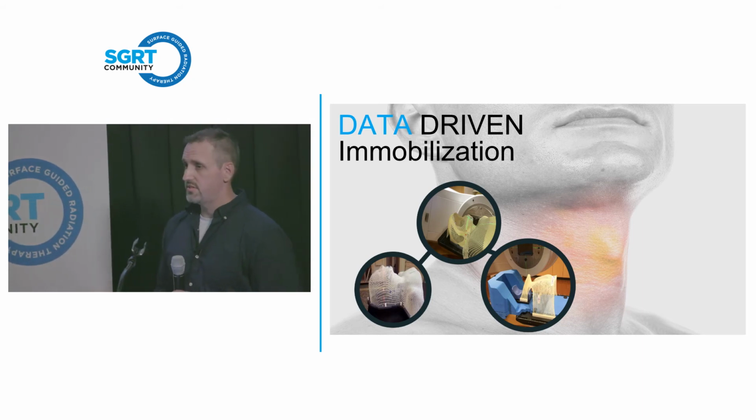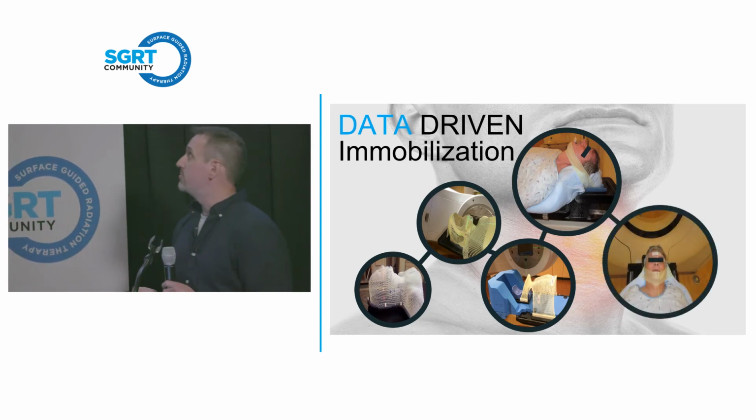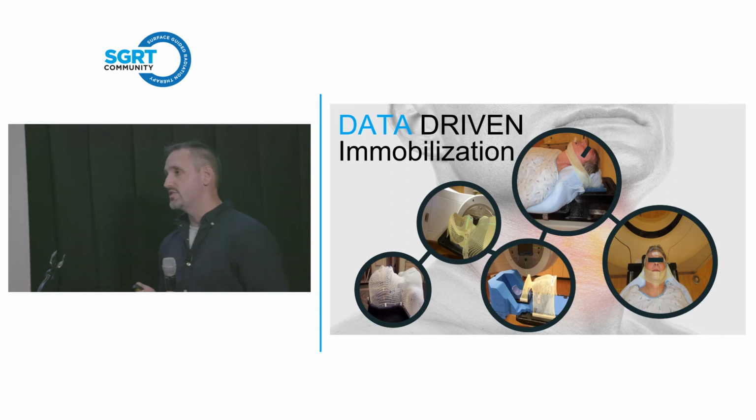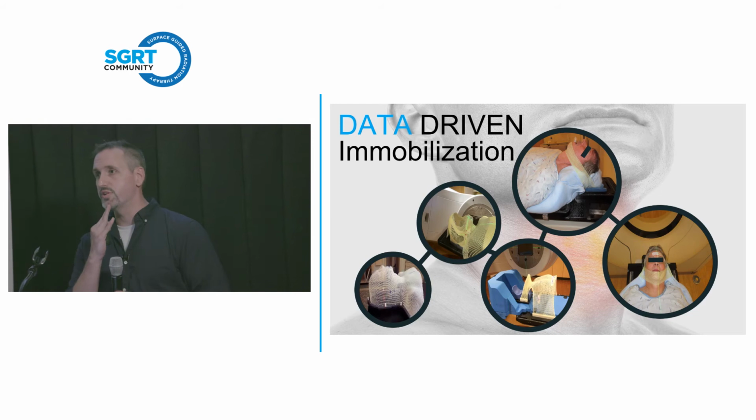Now we're at this. This is not an endorsement for you to try this, please. I showed this data in another talk and got hate mail like you wouldn't believe. This is what we're calling maskless head and necks. So we basically have posterior immobilization. We have a small chin strap mask only on this posterior immobilization. It's relatively loosely fitting. It's only there to give the patient a reference of where the chin needs to be.